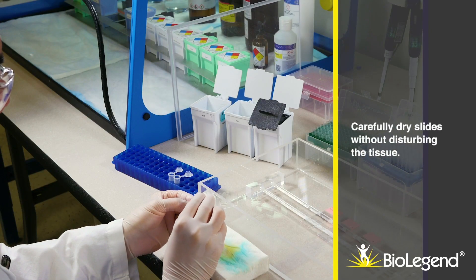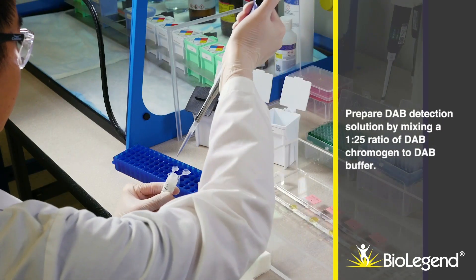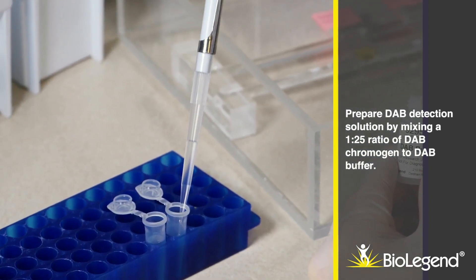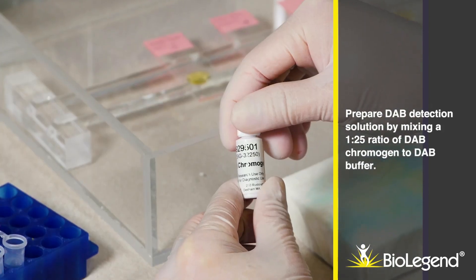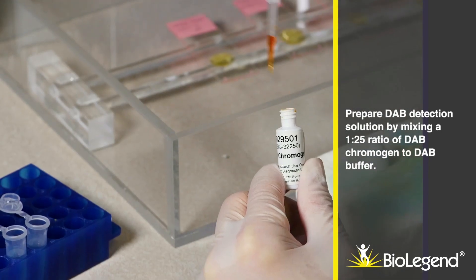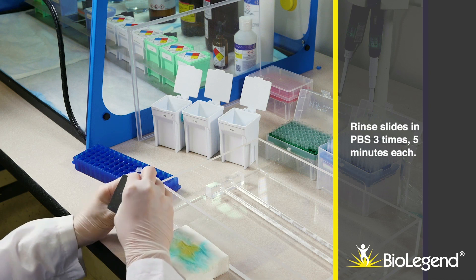Carefully dry slides without disturbing the tissue. Prepare DAB detection solution by mixing a 1-to-25 ratio of DAB chromogen to DAB buffer. Rinse slides in PBS three times, five minutes each.